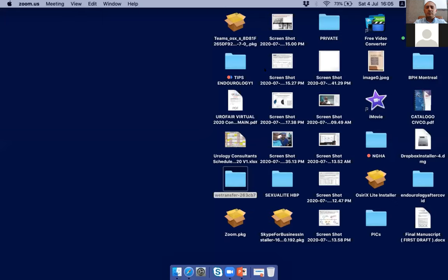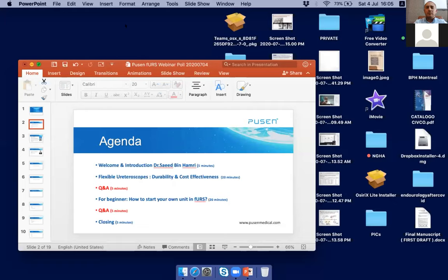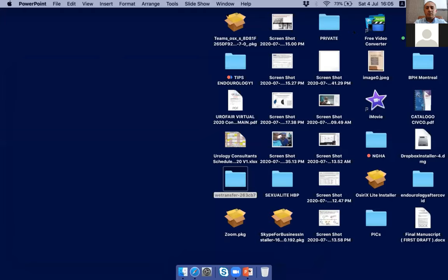I think for low case volume institutions, single use flexible ureteroscope can improve on the high frequent damage rate and reduce the repair cost and also the reprocessing cost and the labor cost. So for the institution, medical center with low case volume, single use flexible ureteroscope is suitable.